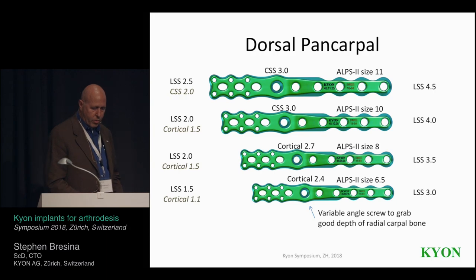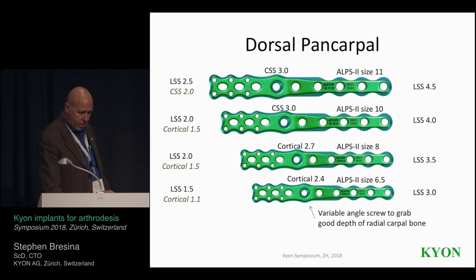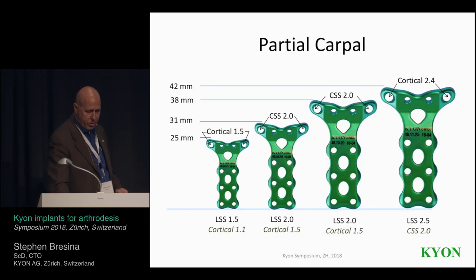So looking at the dorsal pancarpal plate, we have this available in 4 different sizes. So you see you have the locking specialty screws 4.5, 4.0, 3.5, 3.0, all on the proximal ends. And then on the distal end, you've got either a locking specialty screw 2.5, 2.0, 2.0, or 1.5. So all these different plates need a lot of different screw sizes. Again, here's the partial carpal.